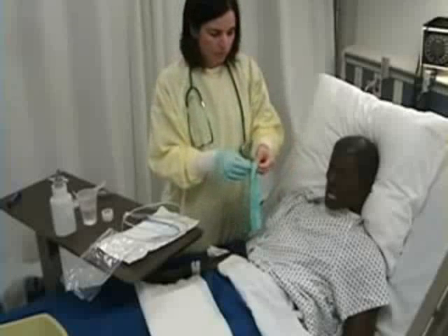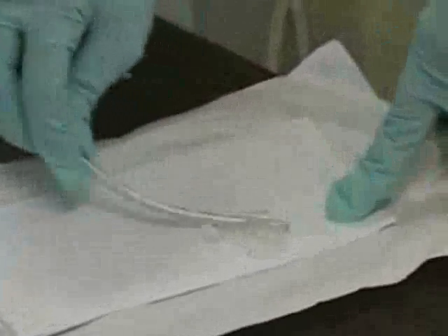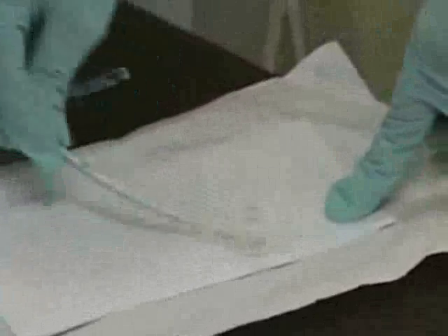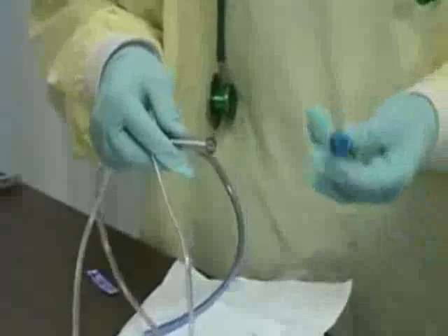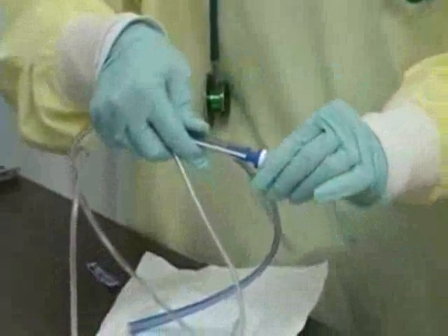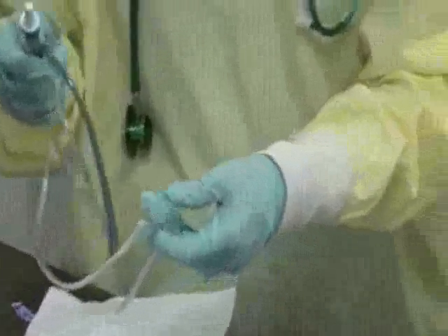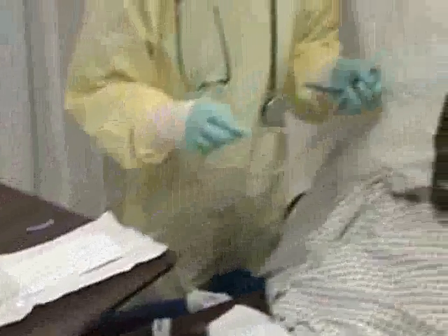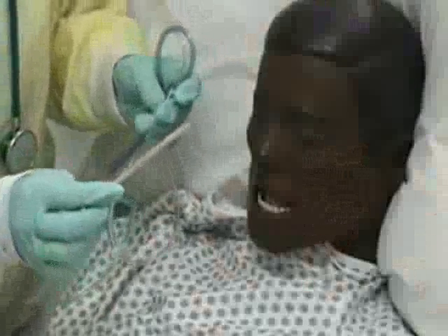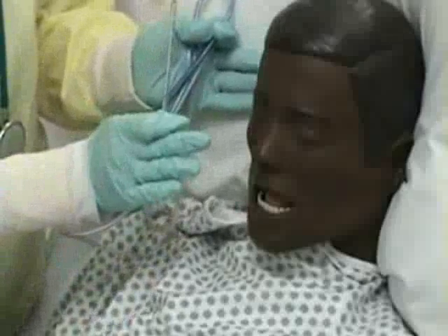But I want to lubricate the first 2 to 4 inches of the nasogastric tube to help it pass more easily. I'm now going to place a cap at the end of my NG tube in the clear portion. And now I'm ready to insert my nasogastric tube. I'm going to give my patient his water and ask him to take sips of water when I prompt him. I'm going to begin by inserting my nasogastric tube with the patient's head either in a neutral position or slightly extended.